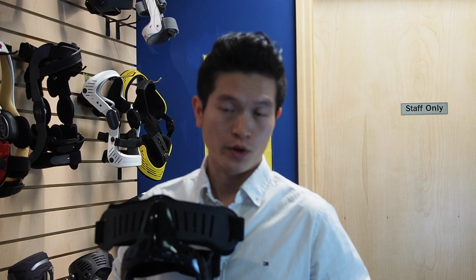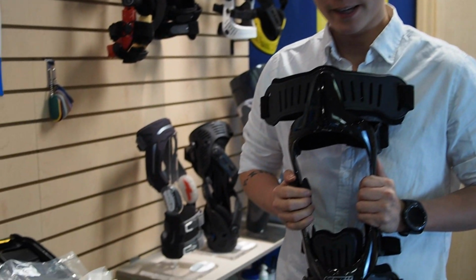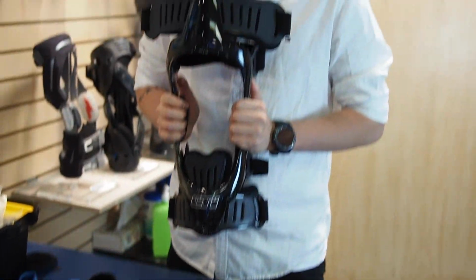So that was a quick tutorial of how to put the brace together. As you can see here, it did take some time, and I do have all the tools I need to do it here. So I do recommend that you take it back to your brace technician so that they can take it apart and put it back together for you.